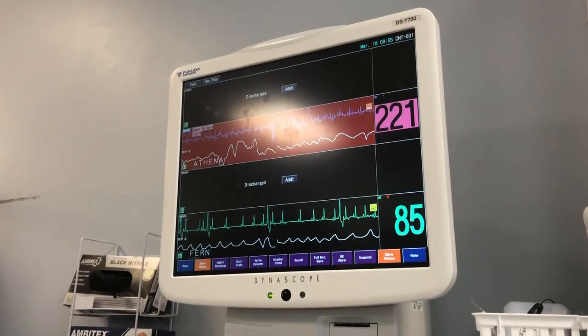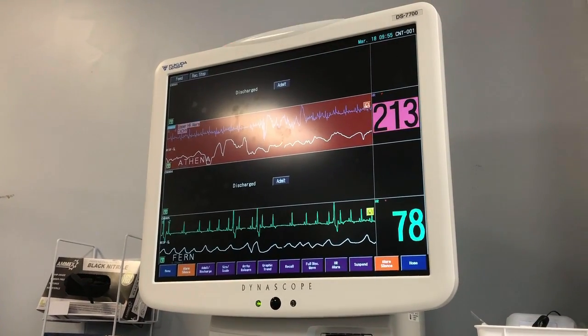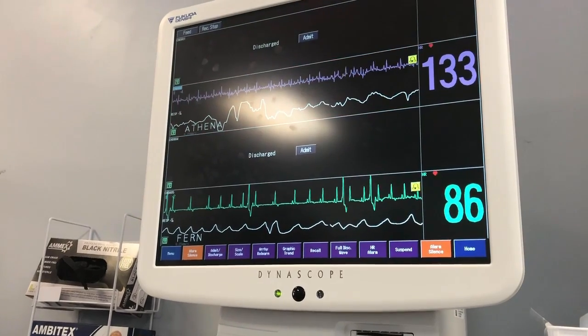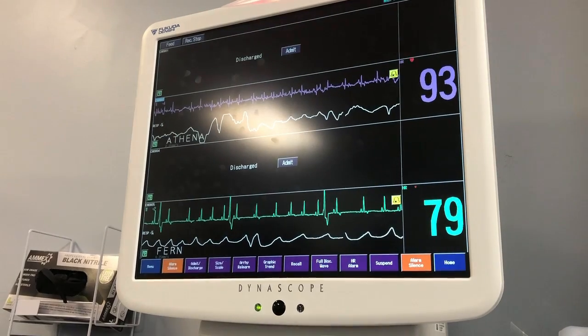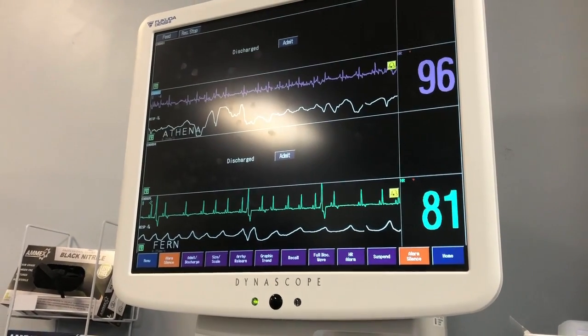And as you see, perfect example, right now her heart rate says it's 227. The manual, you'll hit alarm silence. And what that will do is if any time at any certain point her heart rate goes above what the parameters are, it will start alarming, and you'll hear that sound. It will start flashing in red.